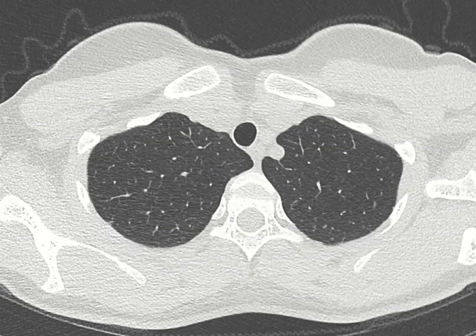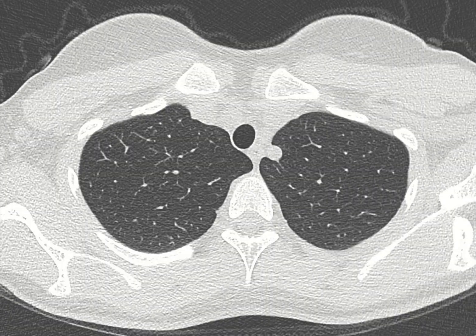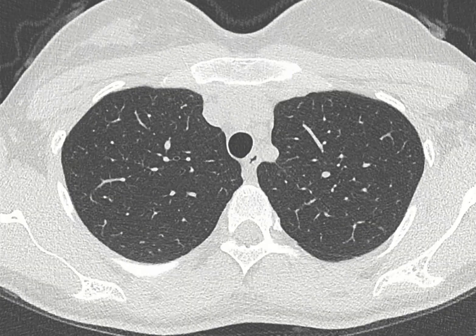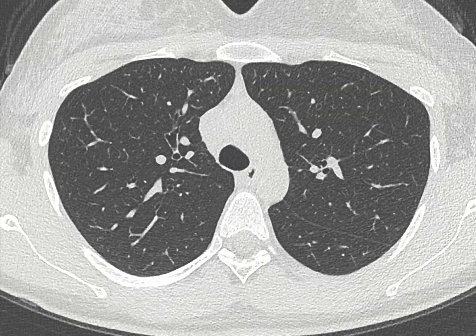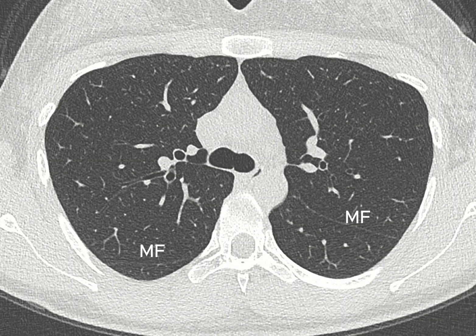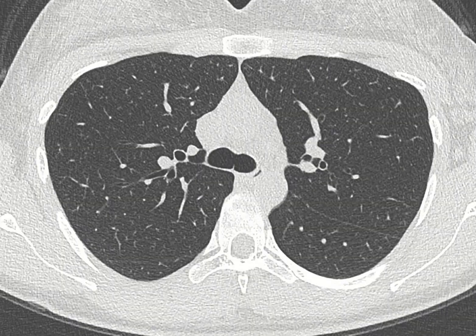So let's dive right into it. We slowly scroll down the CT scan. This CT scan doesn't show a lot of abnormalities — it's actually quite normal. We first see the major fissure on both sides, which is the delineation between the upper lobe and the lower lobe, helping with orientation. First, in the right upper lobe at the level of the main carina, we can find the RB1, which has a cross-sectional appearance because of its apical direction.